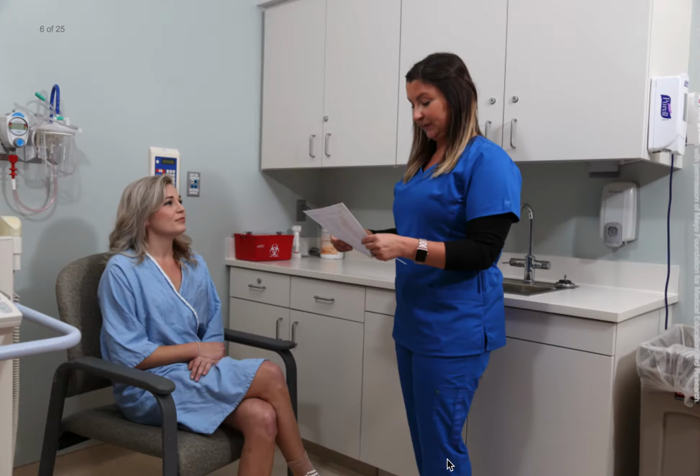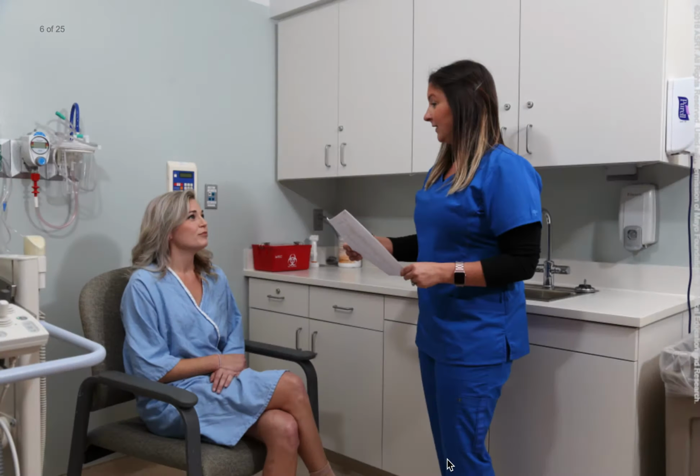Clear communication with the patient will ensure that a proper patient history is acquired and that the patient will comply with all instructions. It is generally good practice to explain the procedure to a patient before exam positioning so that any questions can be answered immediately. Patient history includes a discussion of any known anatomical variants that may impact the exam, as well as any medical devices implanted in the area of interest. For example, technical factors will need to be adjusted if a patient has a joint replacement or severe arthritis.